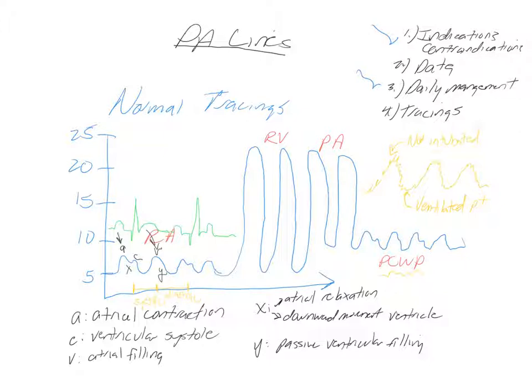So that is all I have to say about normal tracings. We'll next move on to pathologic tracings.